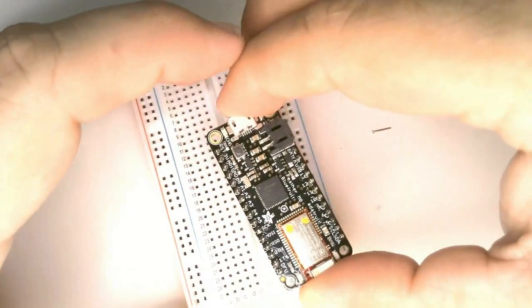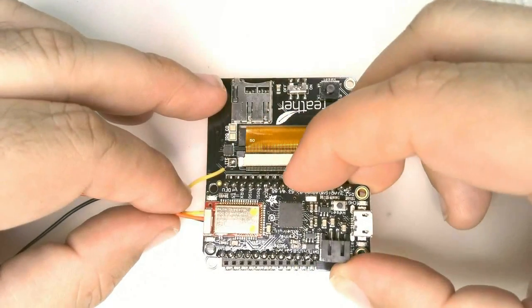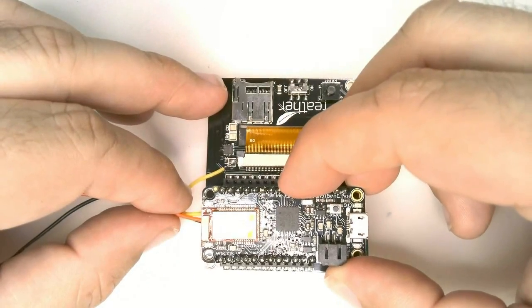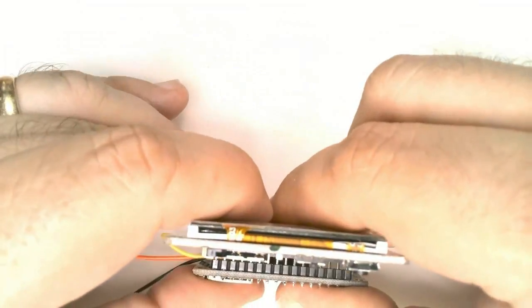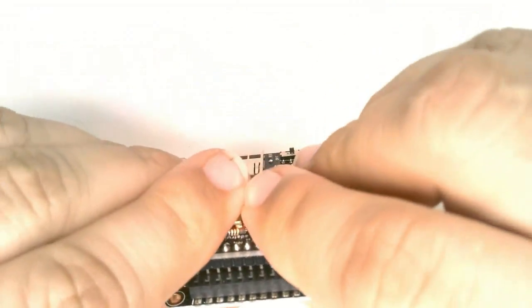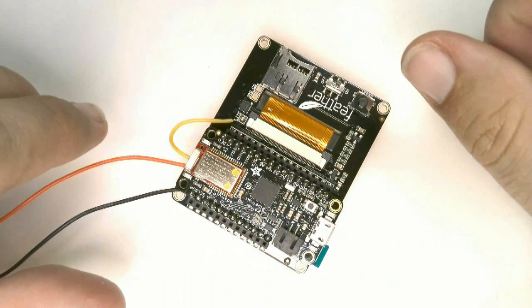Carefully remove the feather from the solderless breadboard and insert it into the display board. Align the pins carefully and push it firmly into place. These particular sockets are shallow, so it won't go flush, but that's okay.